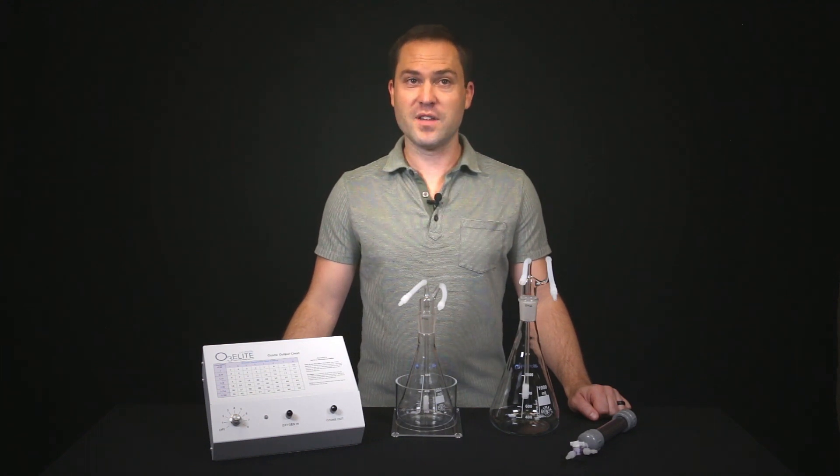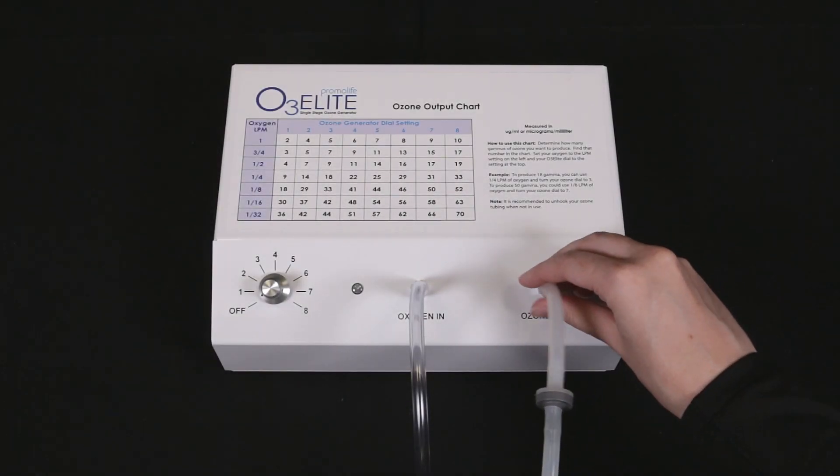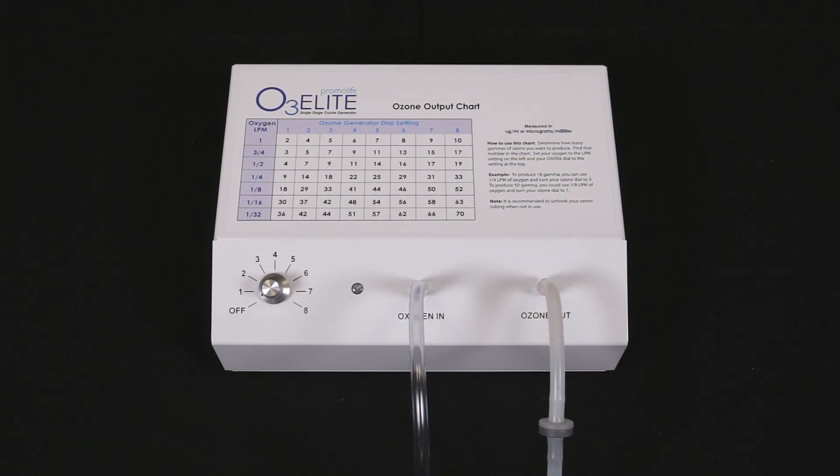Next, I will go over the connections that will apply to both sized jars. To start, you will need to connect the tubing with the check valve and attach tubing to the ozone outport of your ozone generator.